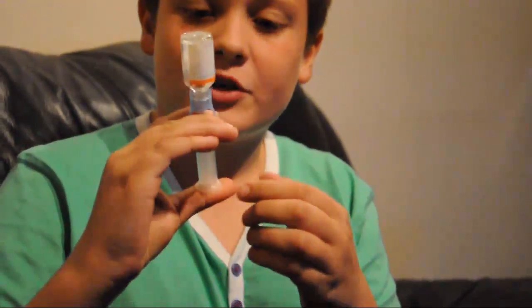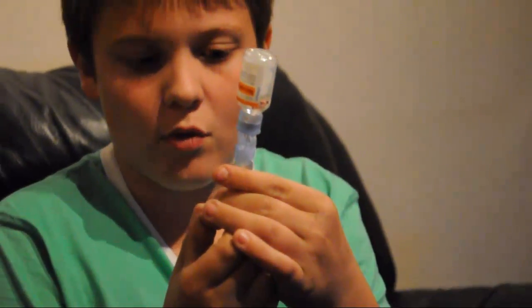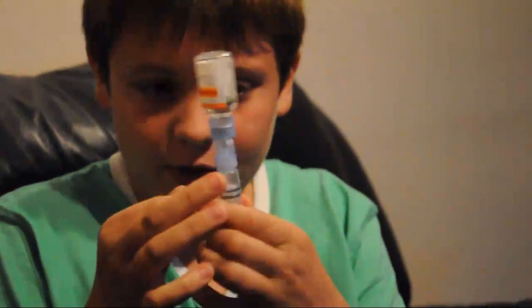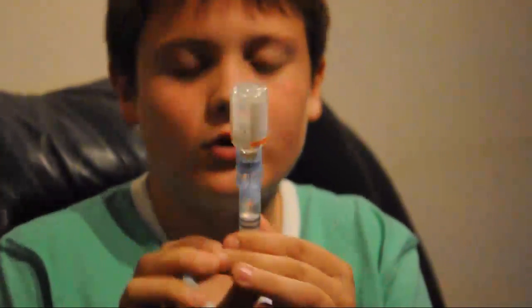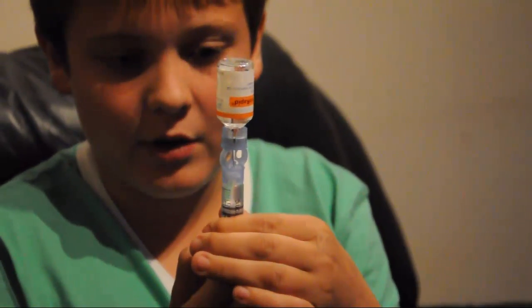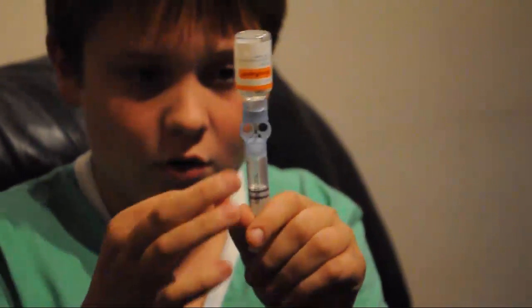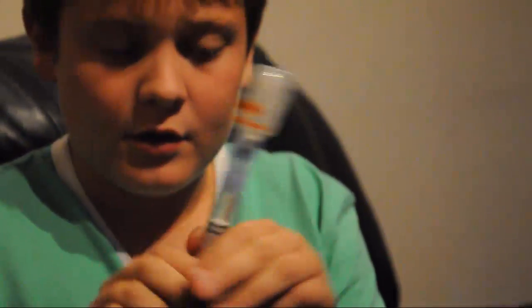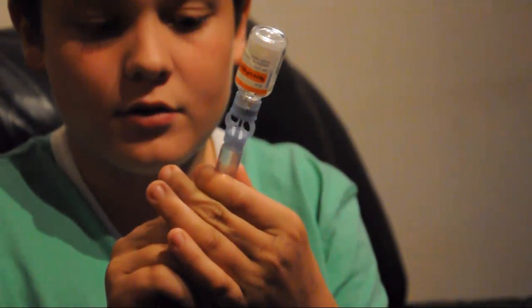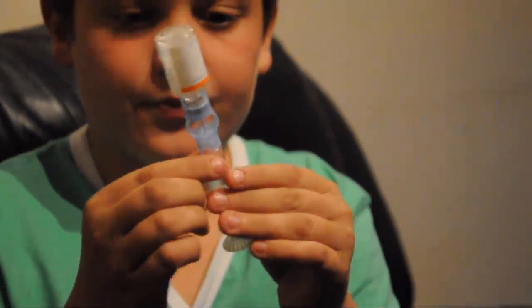And then once that's done, make sure it's right to the top. You just pull this back to about 2 mils, no, 1 mil I think actually. And then if there's any air bubbles, just tap it and push them out. Little ones don't matter as much, but it's best to try and get them out. Then you just put it down to about 2 mils, and if there's any more, tap them, push them out, and you go all the way down to 3, and then just make sure there's none in.